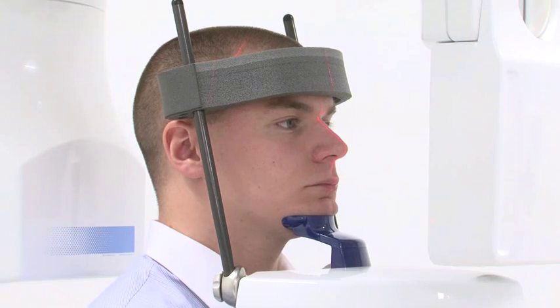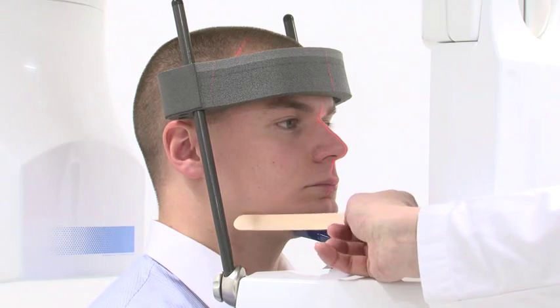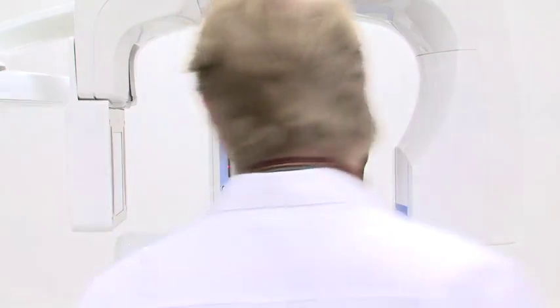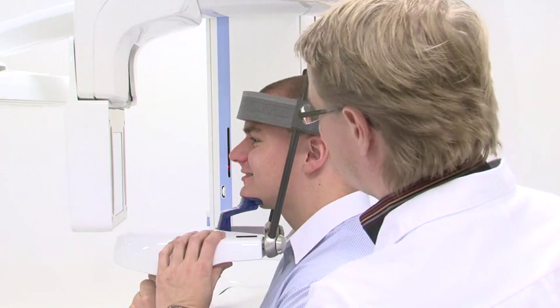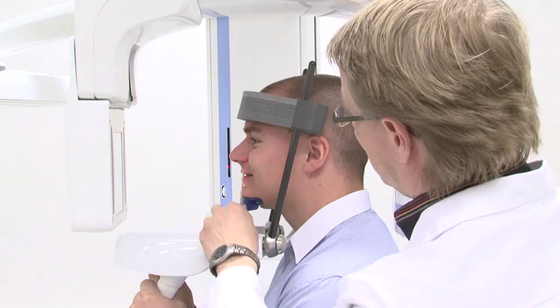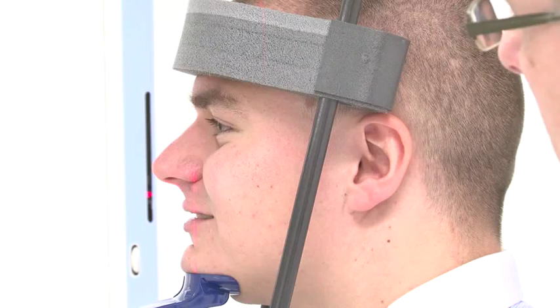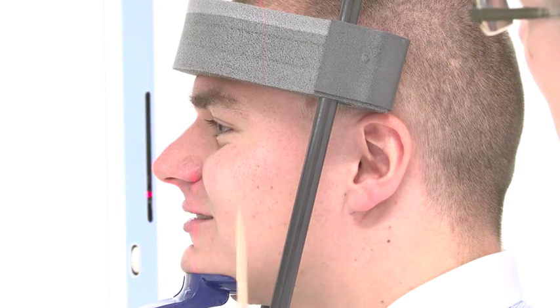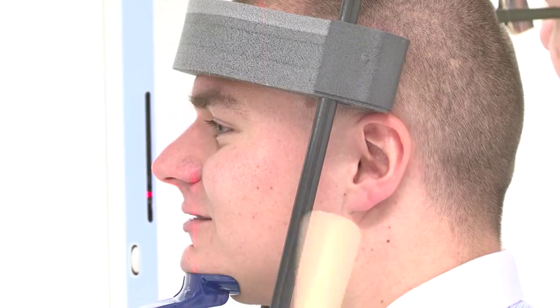The horizontal light at the right side shows the bottom of the volume. Check that it is at the appropriate height. Use the thumb wheel under the patient support table to move the lateral target light. The layer light is a visual reference to denote where the front edge of the volume will start. Move the light to the labial edge of the upper incisors. This will allow the anterior teeth to be in the volume and maximize the rest of the volume to the posterior.